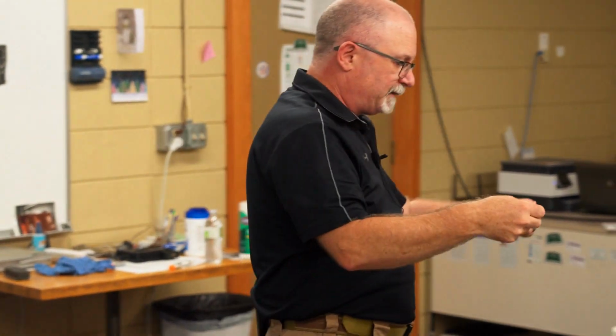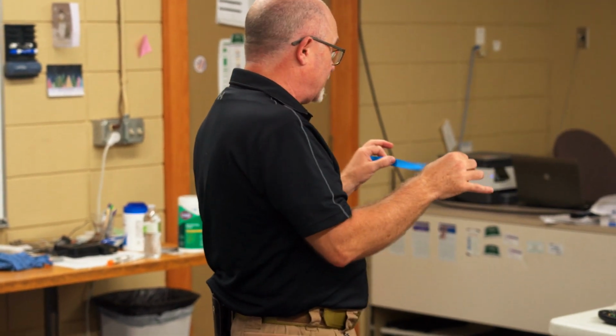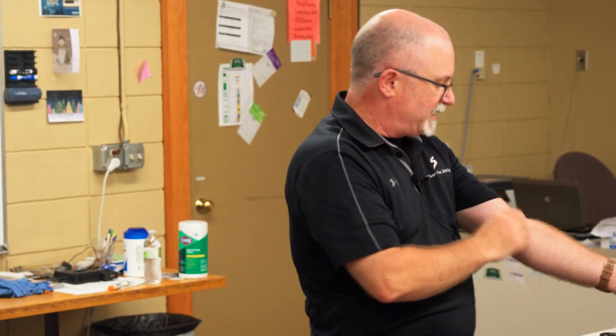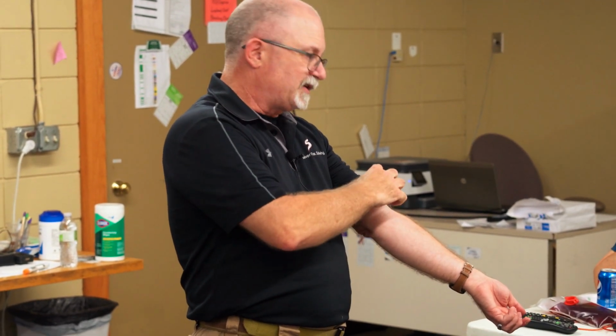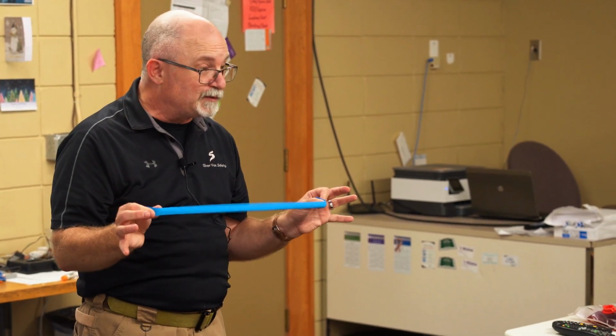So anyway, there's your tourniquet. This is a venous tourniquet. This is not used for arterial bleeds. You guys are probably using CAT tourniquets, as most everybody is. This is not going to work for major bleeding. This is a venous tourniquet because we want to put it on tight enough to stop the blood flow from the veins going back upstream. We block that off, blood starts to build up, and the veins should become a little bit distended. That helps us find where the veins are and start our medication. If you're having a flow problem where you're not really getting a lot of drips, double check and make sure this has been removed.